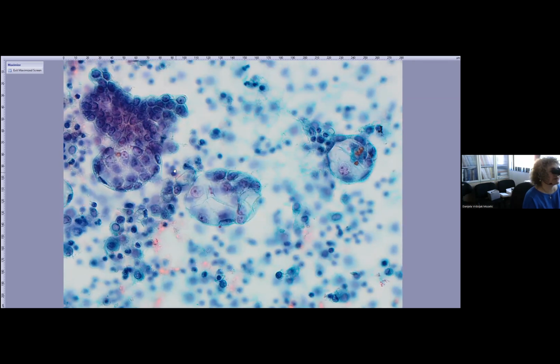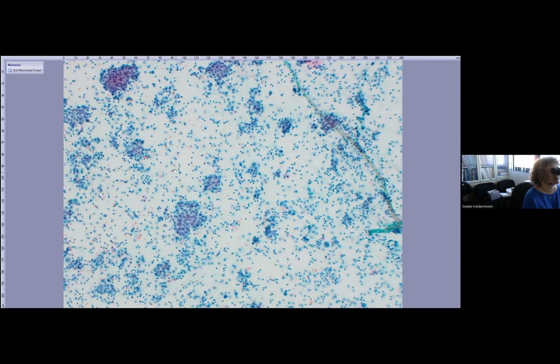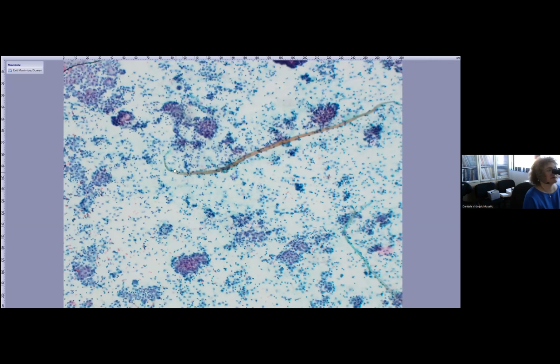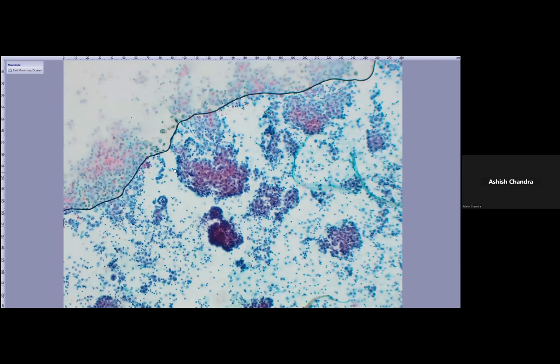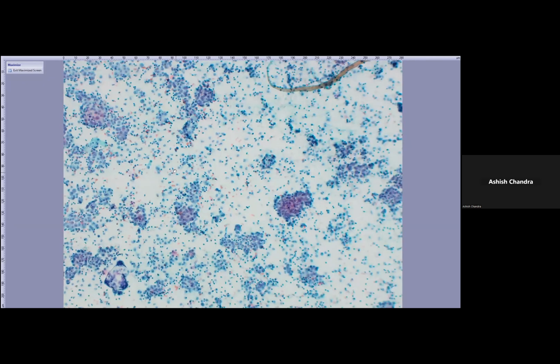When you see red nucleoli, it is always an alarm in any kind of tumor, adenocarcinoma. So three-dimensional papillary structure here, the tumor cells. Okay. And then also the cell block, but I have some on cytology. I will show you immuno later.